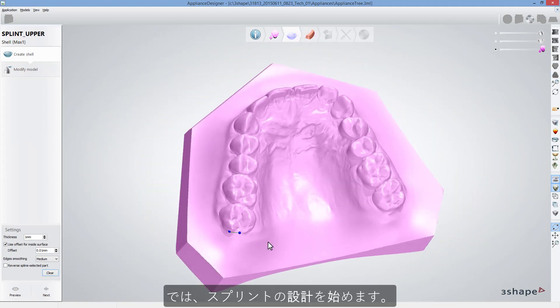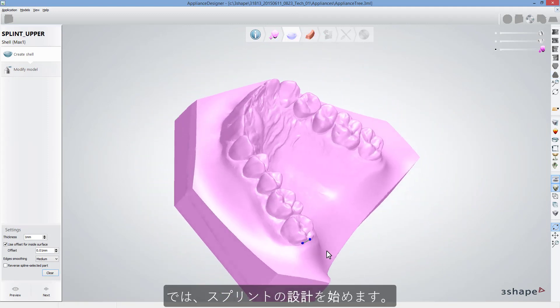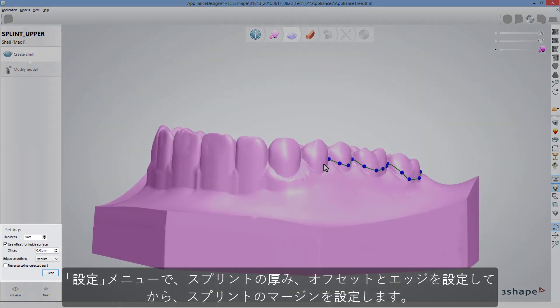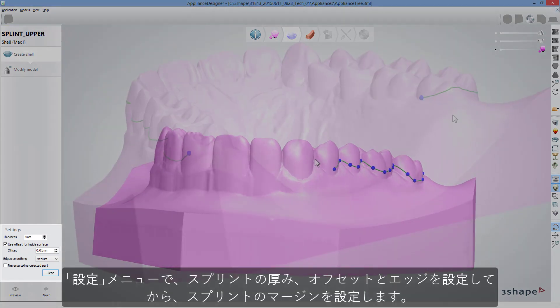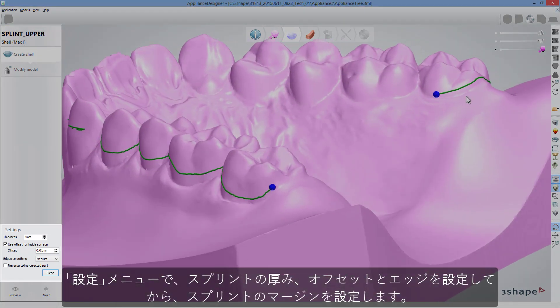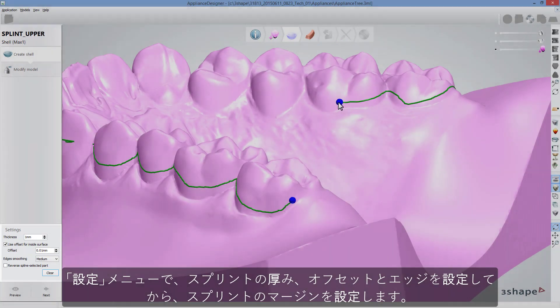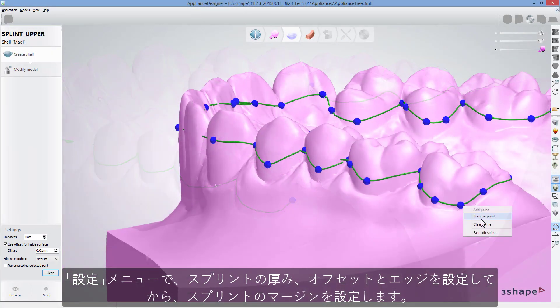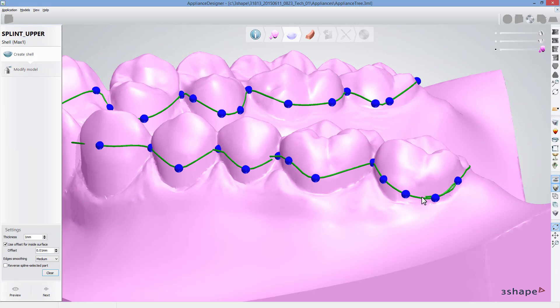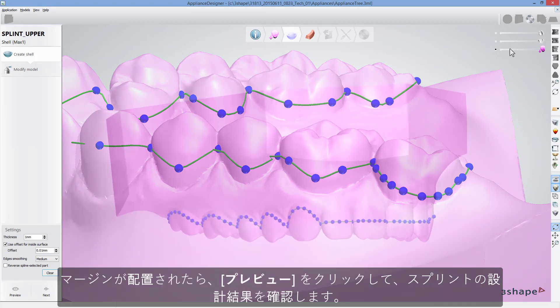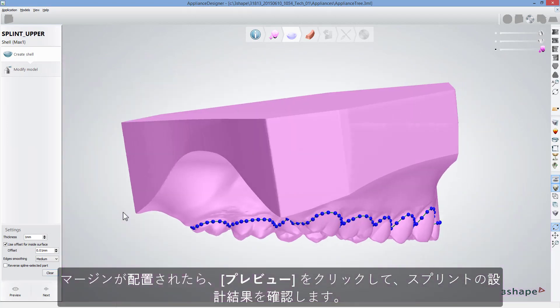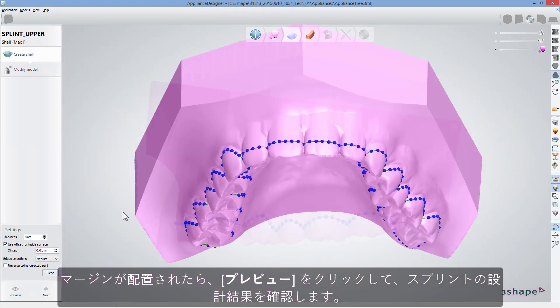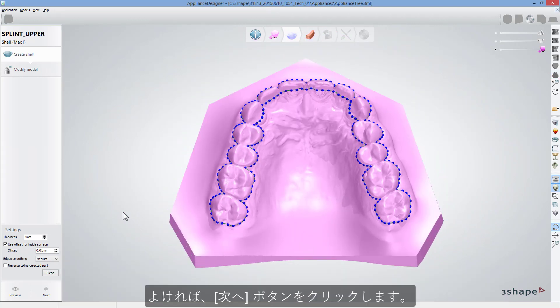Now you can start designing your splint. For that, in the Settings menu, set required splint thickness, offset, and edges configuration, and then set the margins of the splint. When the margins are set, click Preview to see how your splint will look.